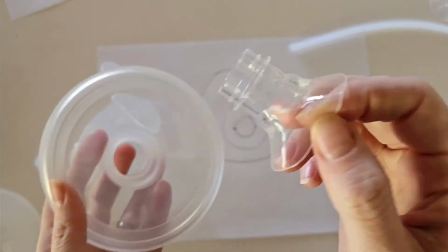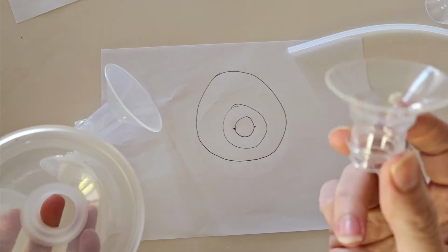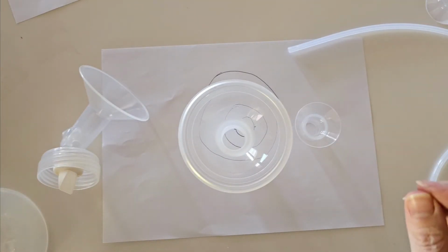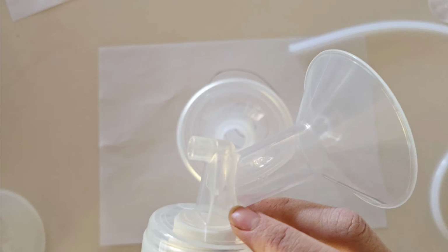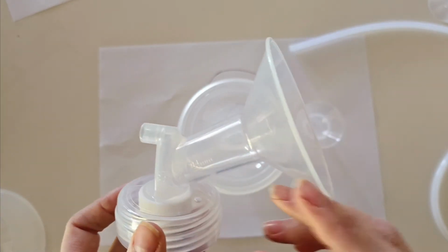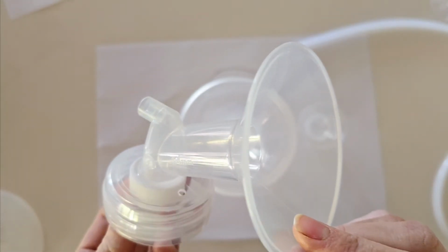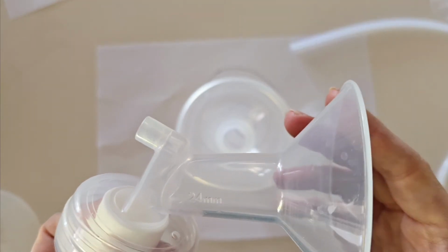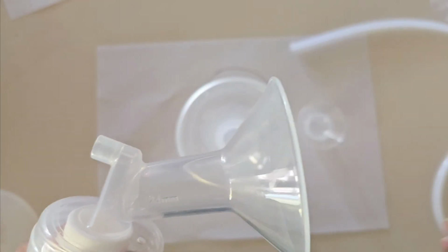Just make sure when you've finished your pumping session that you remove this and make sure that this is also washed, clean and sterilized, because it will come in contact with your breast milk. I feel like I have covered most of it, except for what if your nipple size is larger than the 24 millimeter? Now, most people will generally be around the 24 or smaller, but if you do have the larger nipple size, and your pump is only at 24 millimeter, you will need to look to purchase a larger flange size. Now, the next size up is a 27 millimeter. Sometimes you can find a 28, but it does start getting difficult to find pumps with a larger flange size. So something to keep in mind.